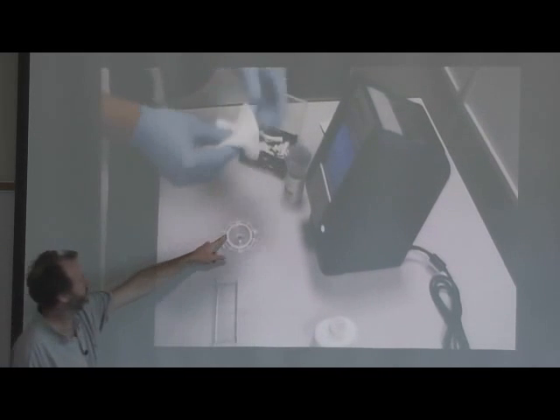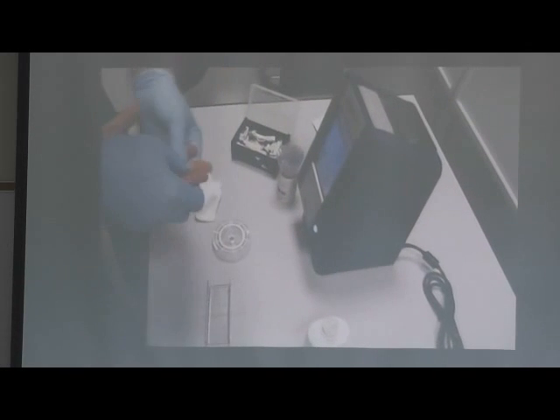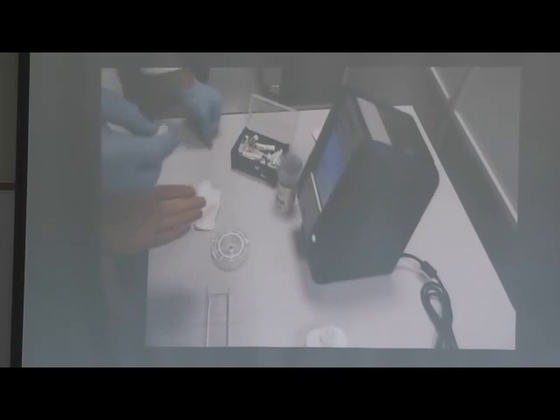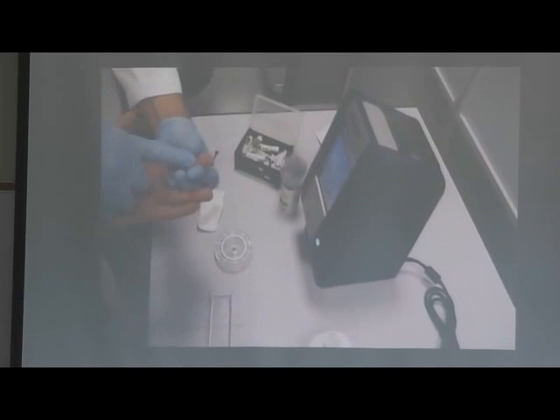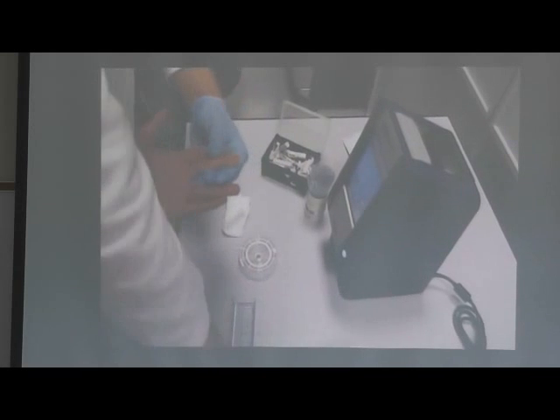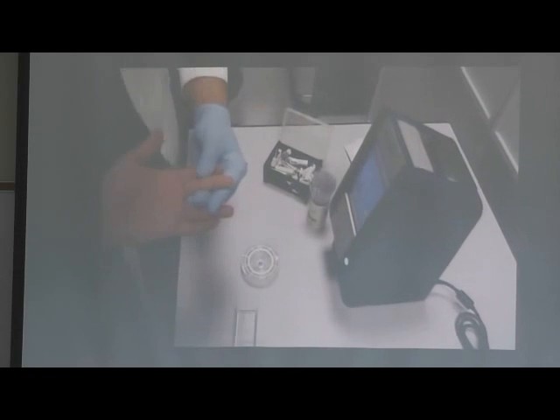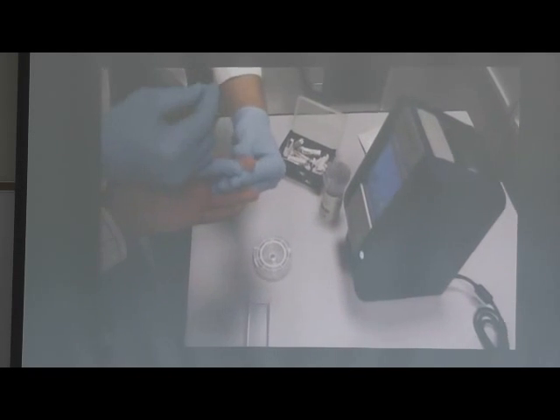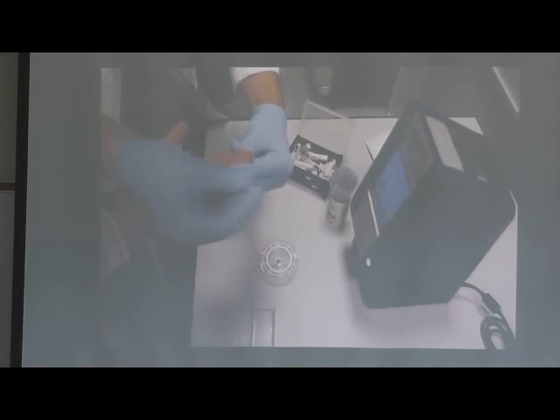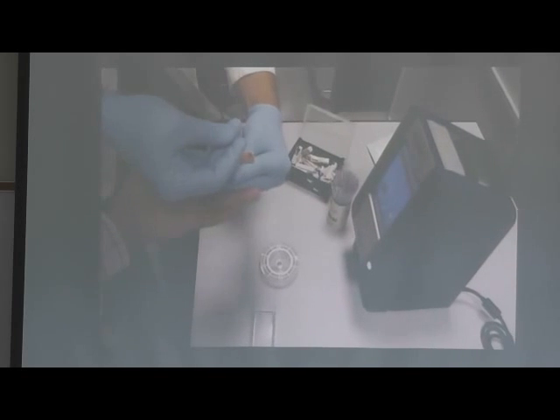Here's one of the little discs, and all you need is 100 microliters of whole blood. And this is what they're going to do. They're taking capillary blood for this test, which is going to resemble what, arterial or venous more? Well, for maybe oxygen, but I think for metabolites, it resembles venous. Bad spot. You're not supposed to milk it? Yep. But it's hard to fill up one of those capillary tubes, isn't it? Yeah, that's why you just do a tube.